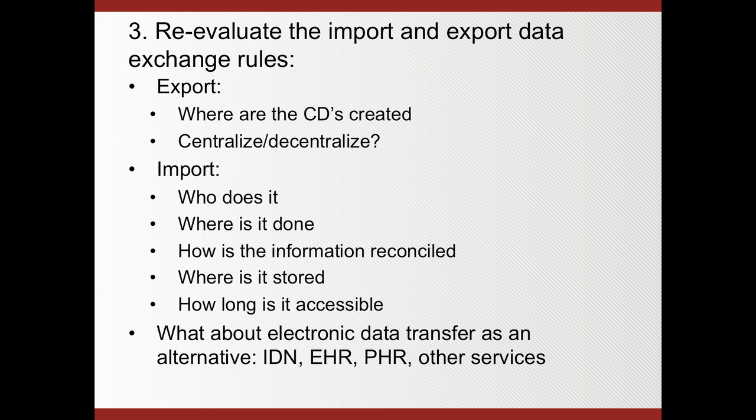Now, a bottleneck in many institutions, and not only a bottleneck but also a source of potential issues and things not working correctly, is quite often the import and export of data. In many institutions, there's definitely an increase in the amount of data that patients bring to the institution. They might have had an MRI or CT done at another location, or even at the same institution, but before they had a PACS system. So you definitely want to reevaluate the import and export rules and how that's being handled.